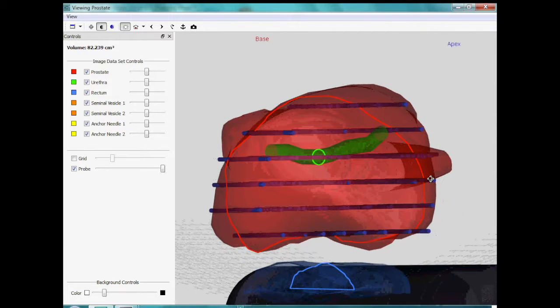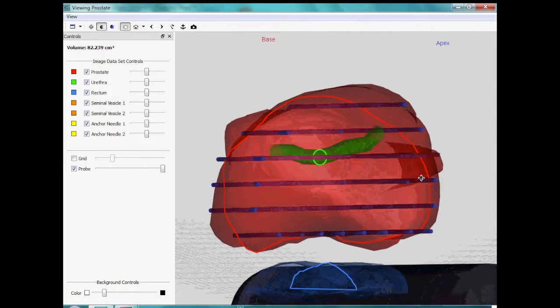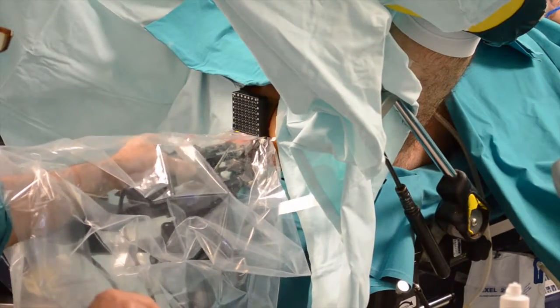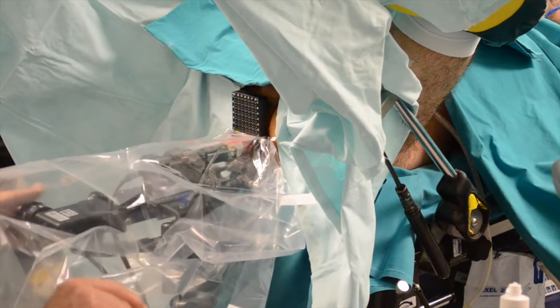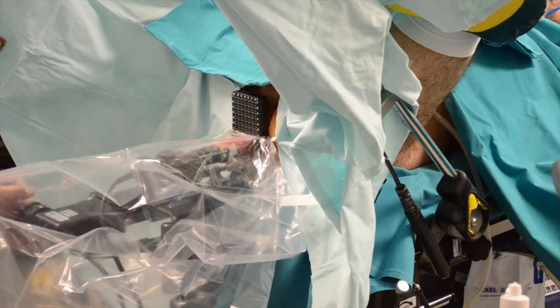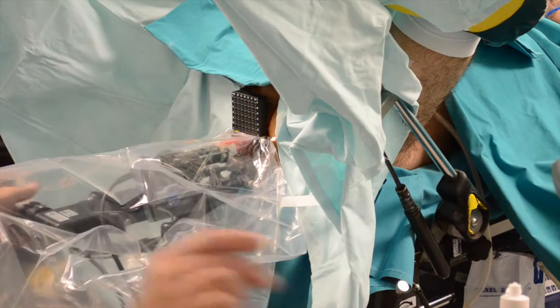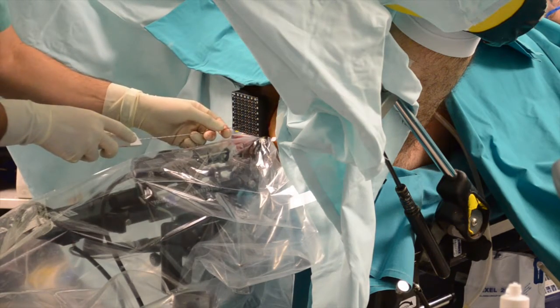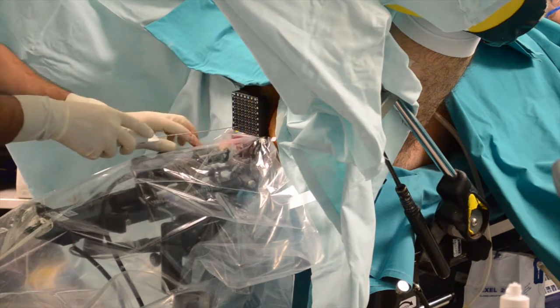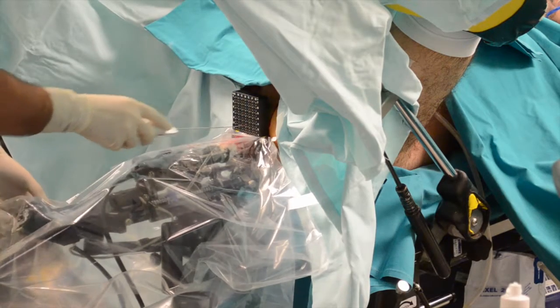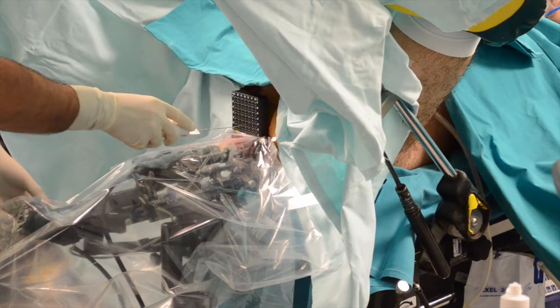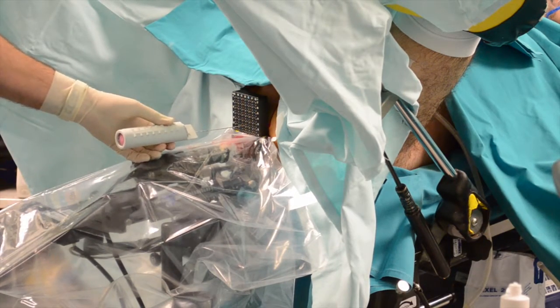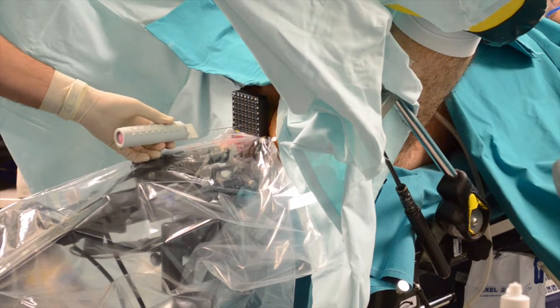Once the plan is accepted, the urologist can start taking biopsies. The prostate is imaged at its midpoint and the urologist inserts the biopsy needle so it enters the prostate at the left upper corner on the grid. That's the same position as the right upper corner on the prostate, or needle number 1.